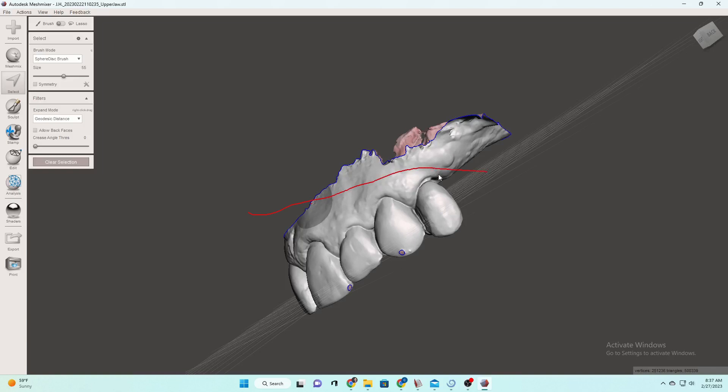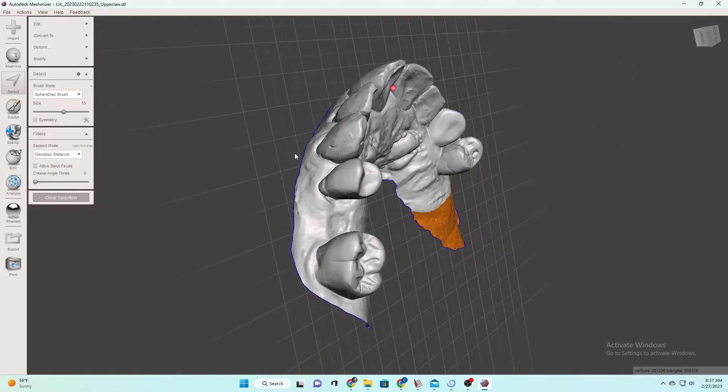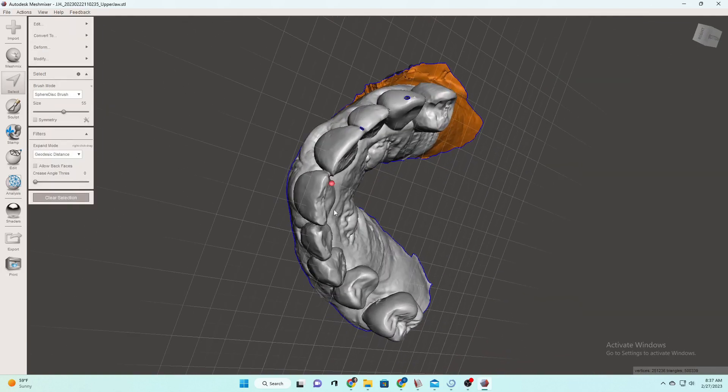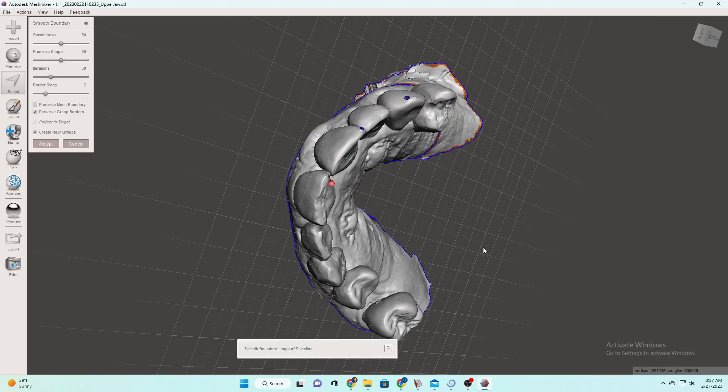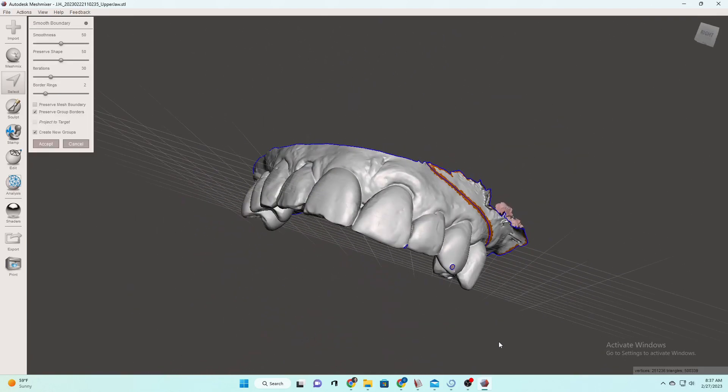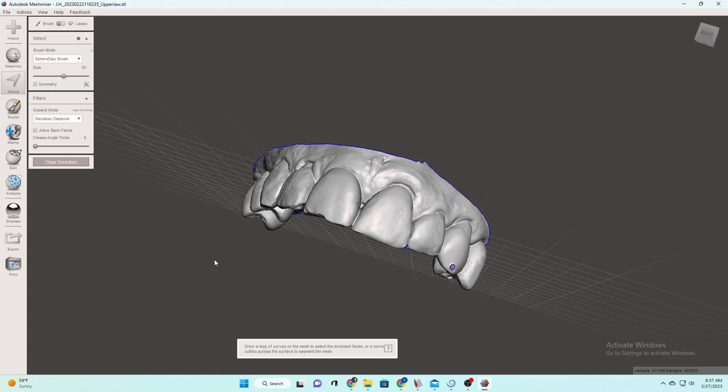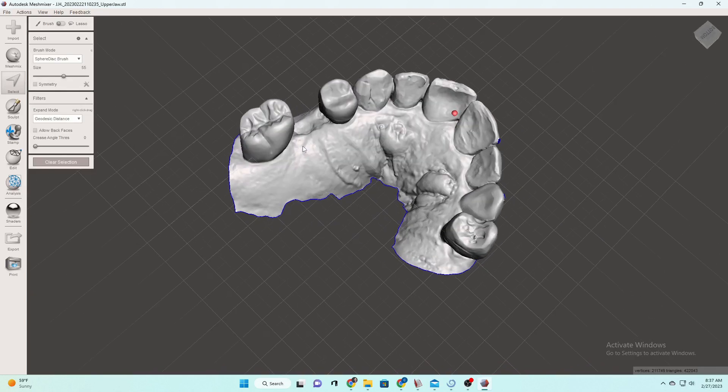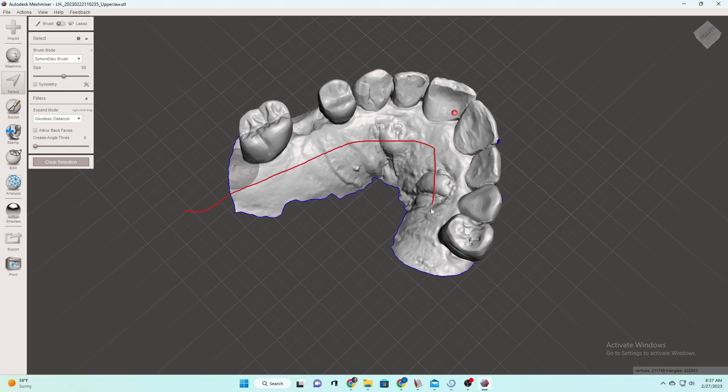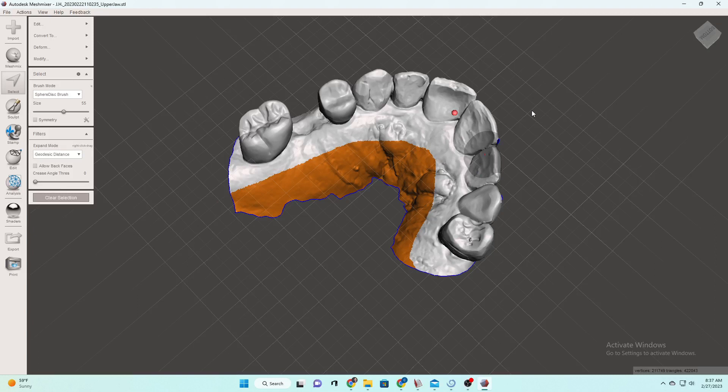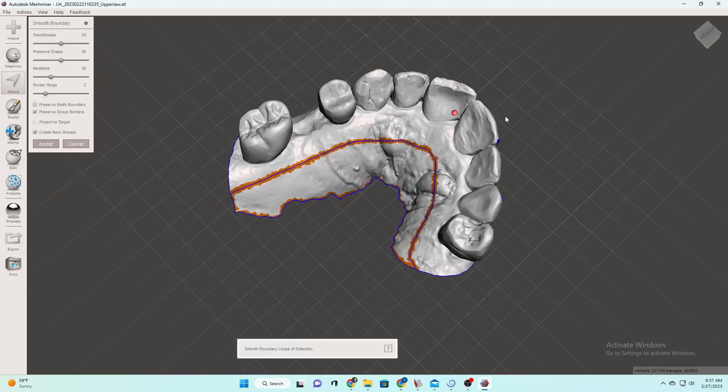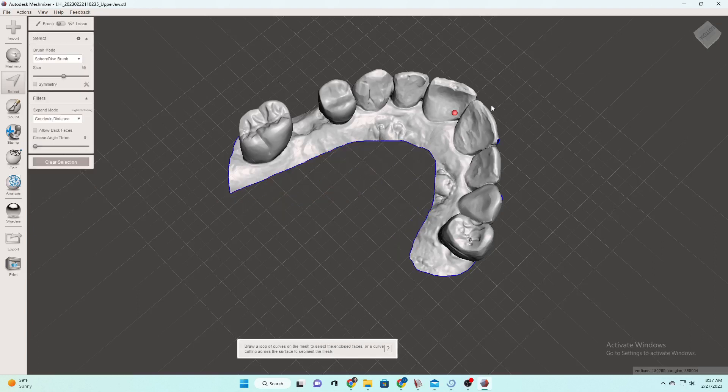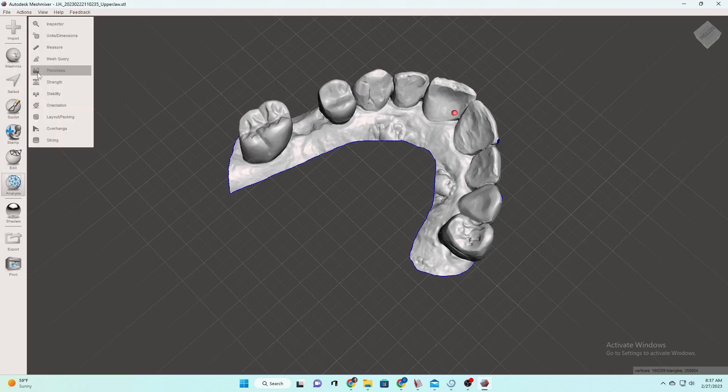And then same thing over here, we're going to highlight what we don't want on our model, B for border and then delete it because we want nice clean models. And same thing. We don't need that full palette on there. We're making a retainer out of this. So just highlight it or shift to unhighlight it and B for border enter. So now we're pretty trimmed up.